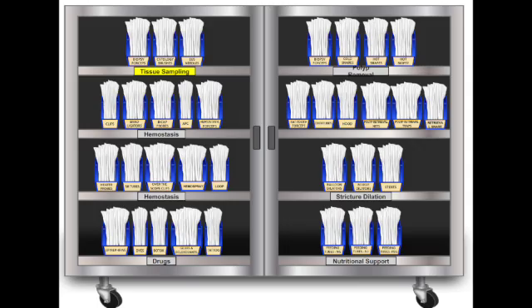Now let's talk energy. The electrosurgical probes. Multipolar, heater, and APC. They all use heat or current, but how do you choose? Good question. There are practical differences. The multipolar probe is probably the workhorse for many types of bleeding. You typically use it after injecting epinephrine to slow the bleeding down a bit. Right. It uses electrical current between multiple electrodes at the tip to directly cauterize the vessel. Great for ulcers, MWS, Dieulafoy, post-polypectomy sites.